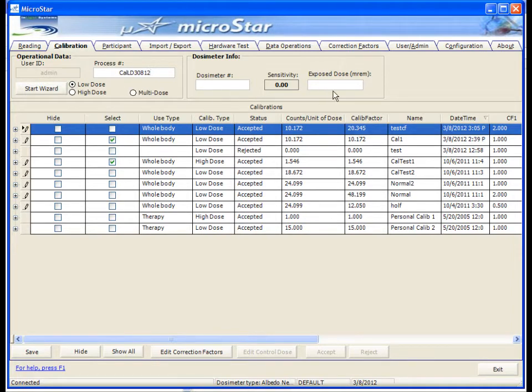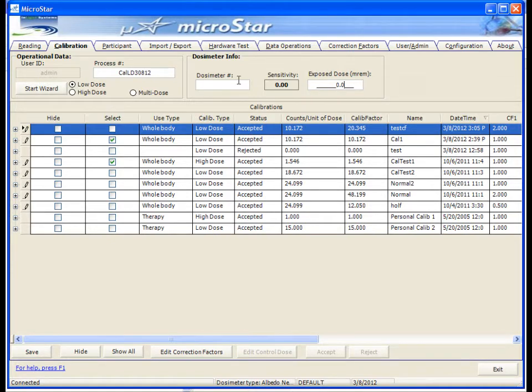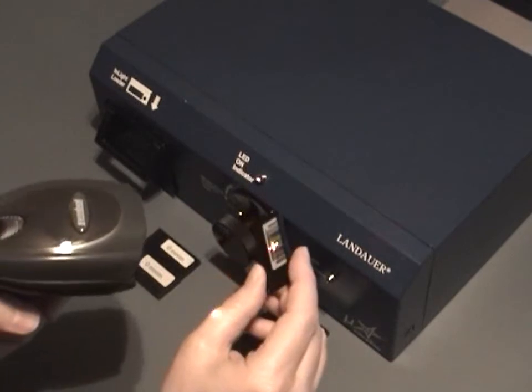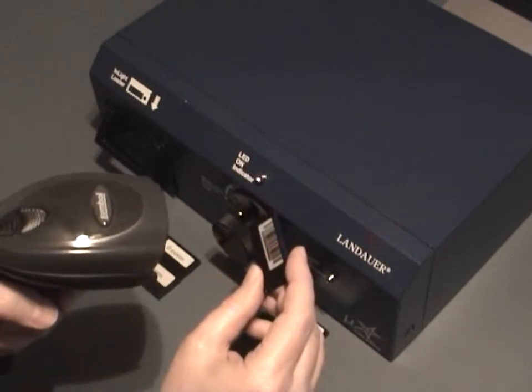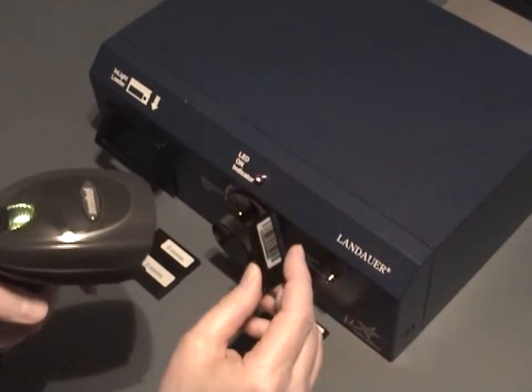Enter in the dose value of the badges you're going to be reading. Place your cursor in the dosimeter number field. Then scan or type the serial number of the first badge you're going to read.